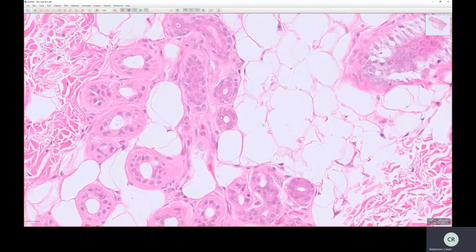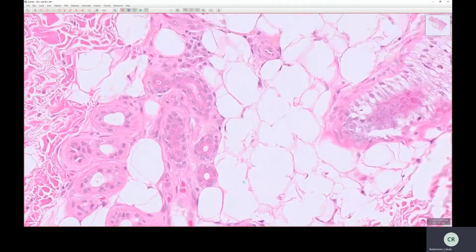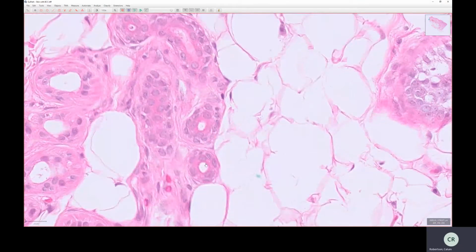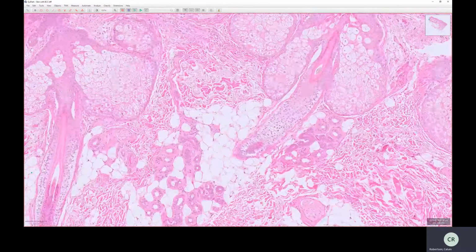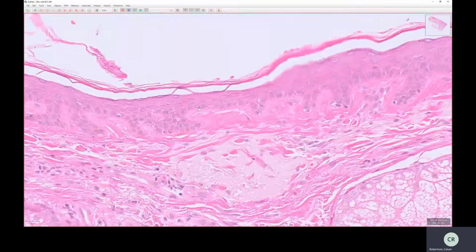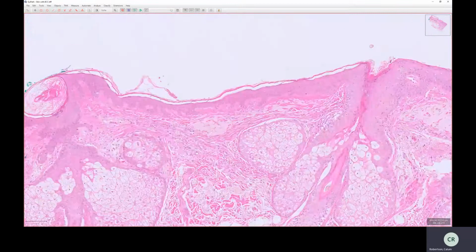And here, this ductal component is supposed to have two cells. It's supposed to be bilayered. So maybe that's got one layer and then another layer beyond it. And the way I can usually tell the ductal cells is because they've got this more intense pink luminal aspect. So this is the ducts. So it's producing sweat in these coiled glands, and then it goes up through the duct all the way up here, up to the surface, and it will open up through an opening in the epidermal surface up here.